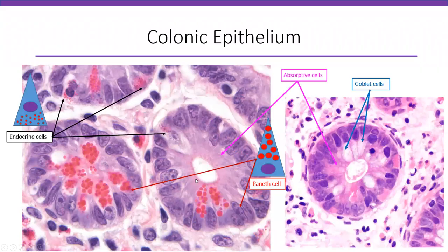On this high-power image you can again see goblet cells — the mucin-filled cells with nuclei at the base — and absorptive cells in between as the pink cells. Paneth cells are the cells with chunky granules located towards the apex, towards the lumen. Endocrine cells have tiny granules towards the base, with the nucleus on top.